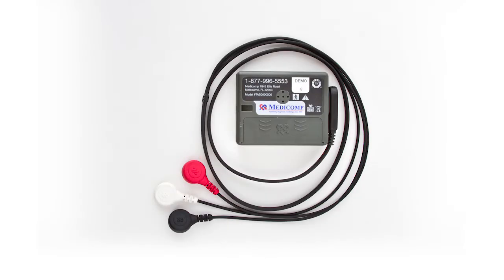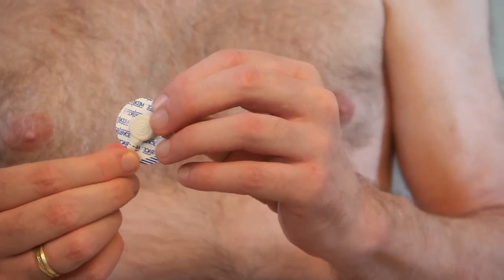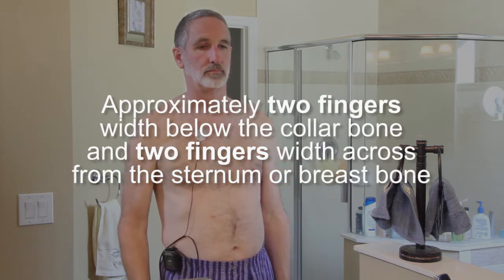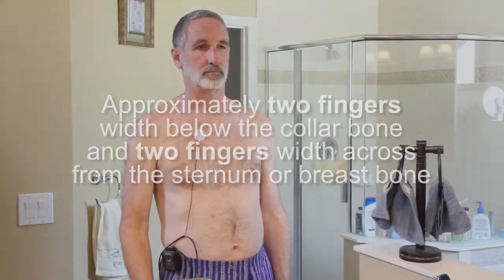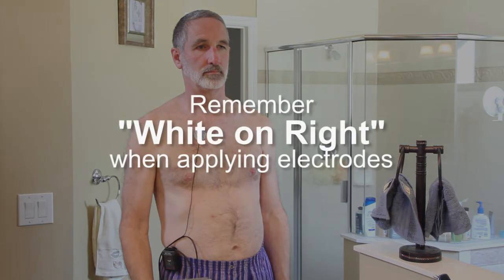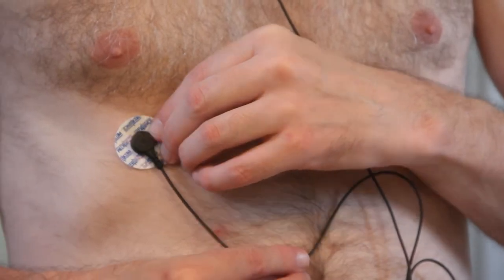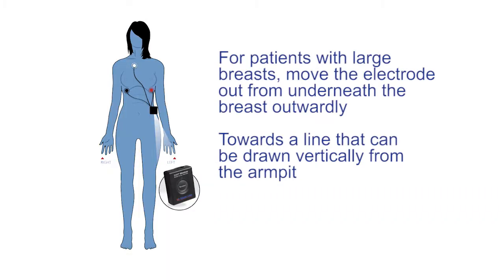Applying the electrode patches. Find the patient cable. First, take the wire with the white terminal and snap it onto one of the electrode patches. Peel it from the plastic backing and apply it to the upper right area of your chest, approximately two fingers width below the collar bone and two fingers width from the sternum or breast bone. Remember: white on right when applying electrodes. Now take the wire with the black terminal, snap it onto a patch, and apply it to the lower right below the white one — over the first rib you feel below the breast, in a direct line down from the midpoint of the collar bone. For those with large breasts, move the electrode more outwardly towards a line drawn vertically from the armpit.